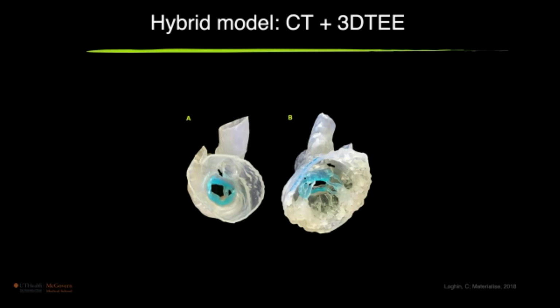Last but not the least, we can use our cardiac CT data to create 3D models. This is a particularly different model from most. In my knowledge, it is the only one that's hybrid because it used a 3D echo data set and a CT angio data set, and their Cartesian coordinates were co-registered, so we made sure to look at the same structures in both data sets.